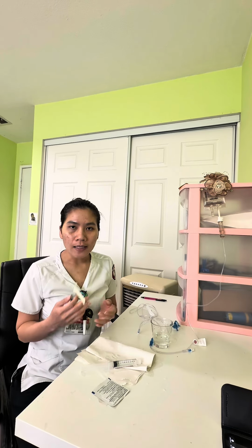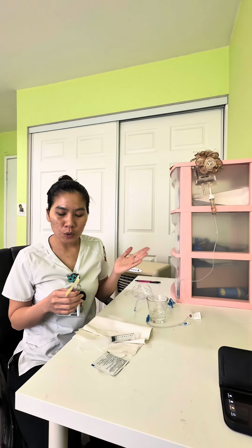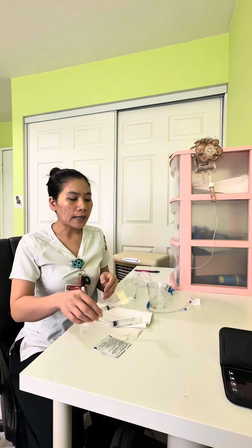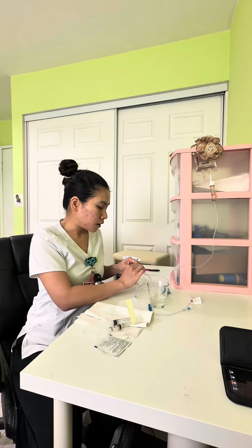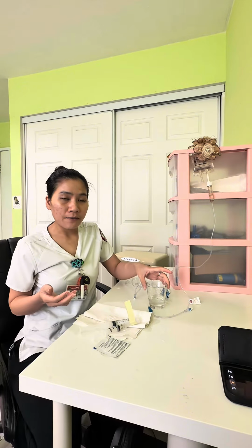Before I give the patient medication, I verify the doctor's order. I check with right patient, right dose, right route, right time, and right medication. Because the patient has a running solution, I also check the compatibility between the medications, and the medication that is running is incompatible with furosemide. So I'm going to clamp it, and stop the running solution before I give the patient the IV push.